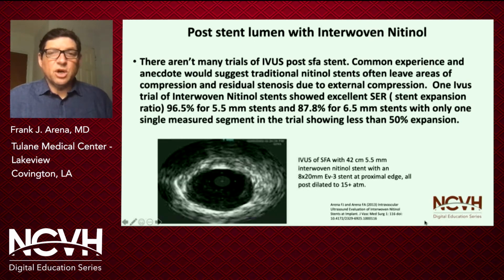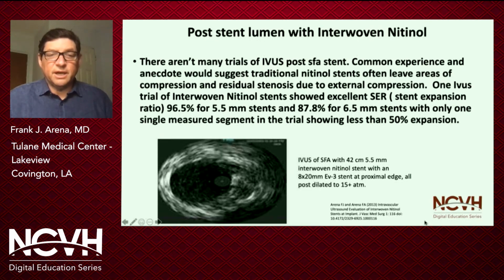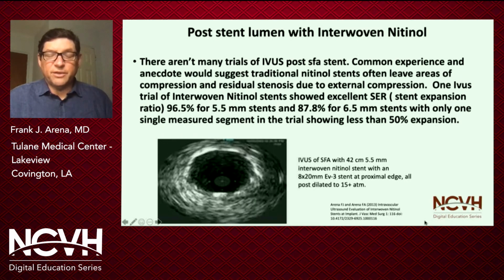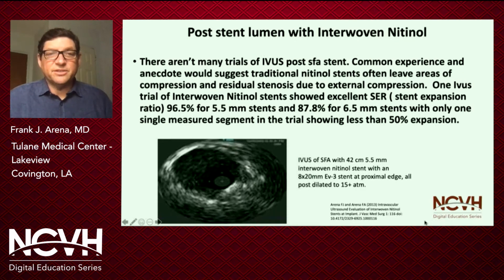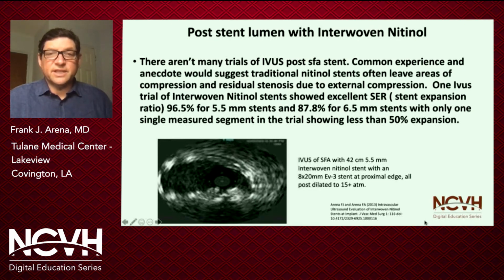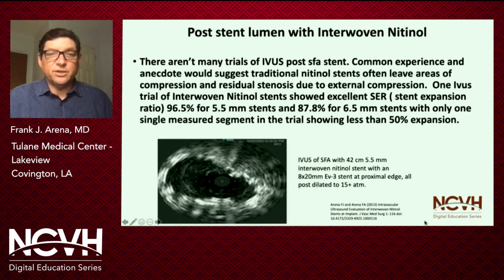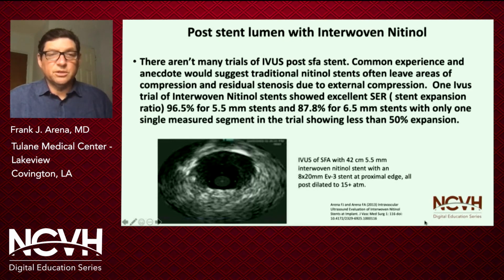Now, this matters because when you do intravascular ultrasound of these stents, and I would really recommend that people do that so they can learn how their stents look, and learn how the rest of the artery looks, especially if you have the opportunity to do it with the leg bent. There aren't many trials of intravascular ultrasound in SFA stents, but if you do these ultrasounds, common experience and anecdote would suggest that the nitinol stents often leave areas of compression and residual stenosis due to external compression.